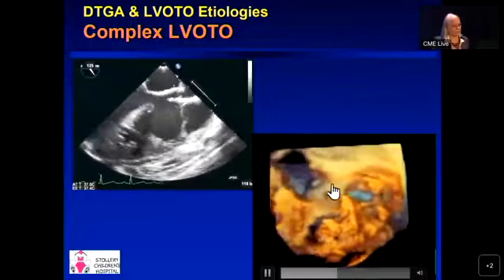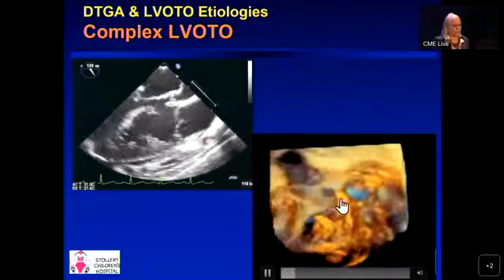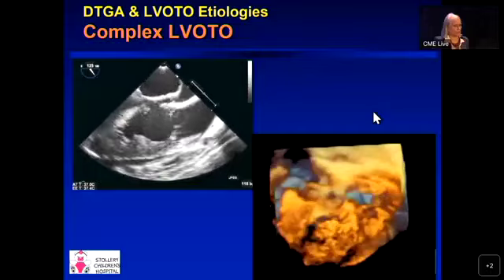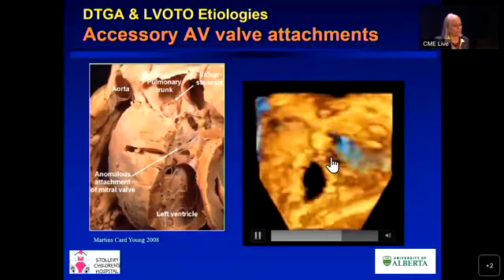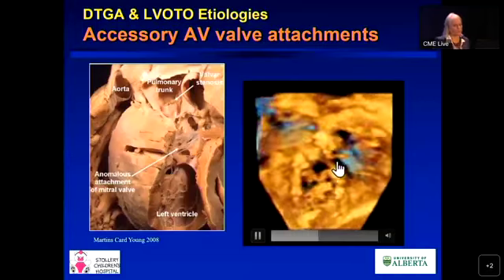They like to do 3D in our program, and this is your little pulmonary outflow, and it just shows you the pathway from the left ventricle into the aorta that would be prime for a Rastelli. So sometimes you do have AV valve tissue, and honestly, I've seen a couple of times folks try to resect this in newborns, which doesn't work well.